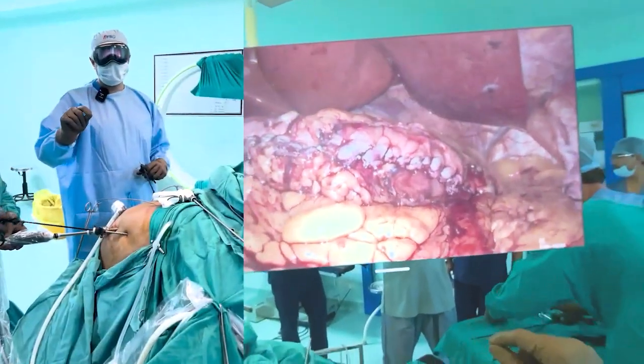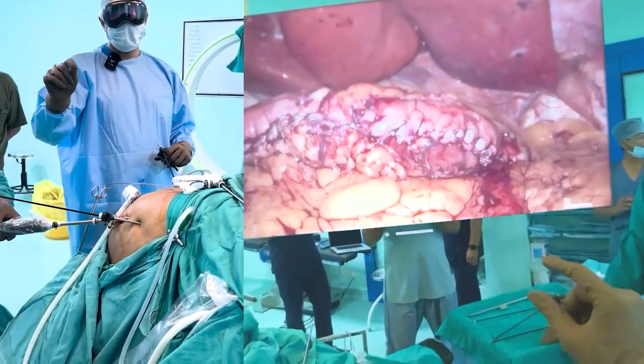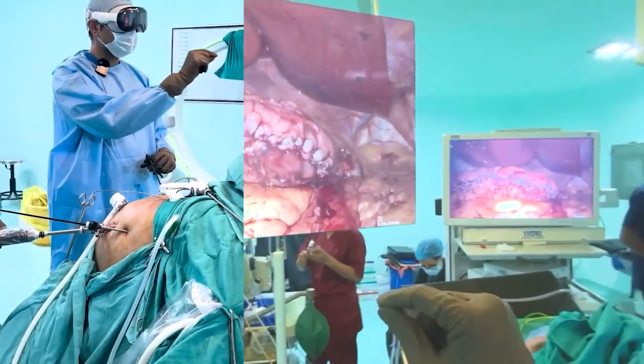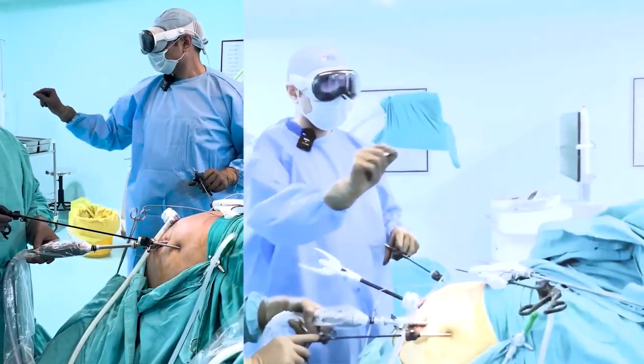We are using a Vision Pro headset to do a laparoscopic sleeve, which we just completed. As you can see, I can take the screen across the theater and position it anywhere I want.